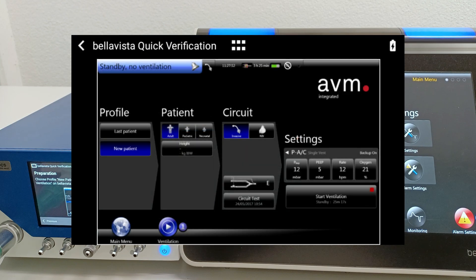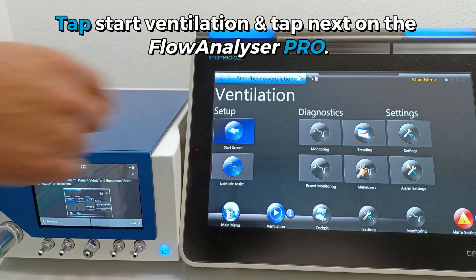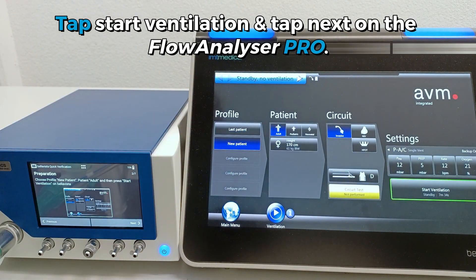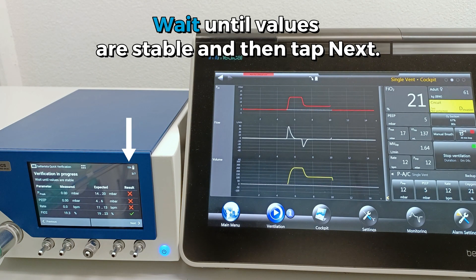Tap Next and follow the instructions to prepare your BellaVista ventilator. Start Ventilation and tap Next on the Flow Analyzer Pro. Wait until values are stable and then click Next.